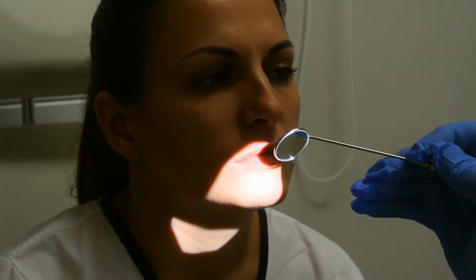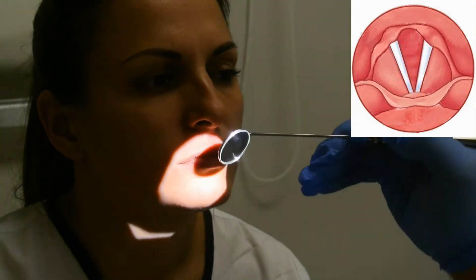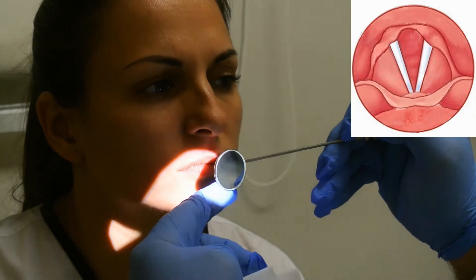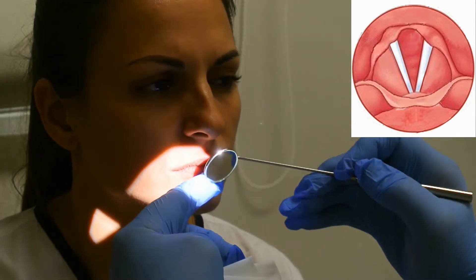By tilting the mirror 45 degrees we will be able to do this, and we can check the side of the hypopharynx on one or the other side by appropriately tilting the mirror in the different directions.